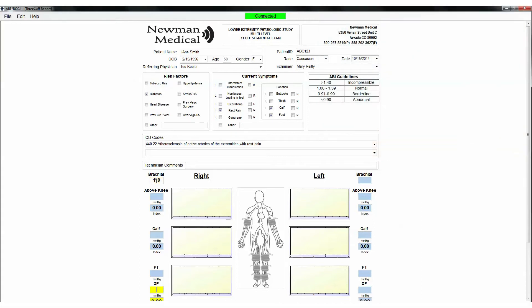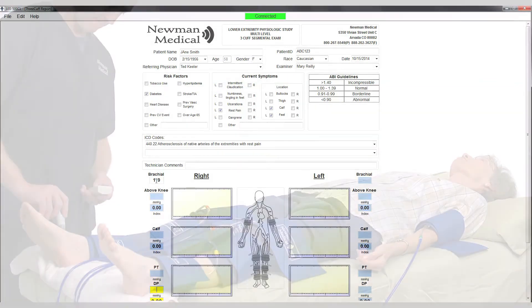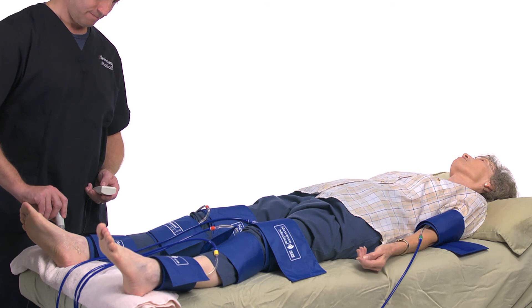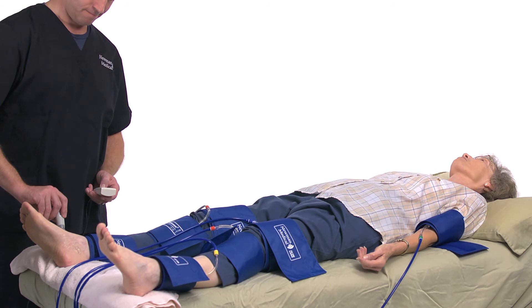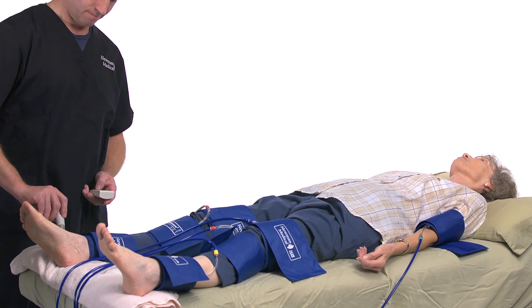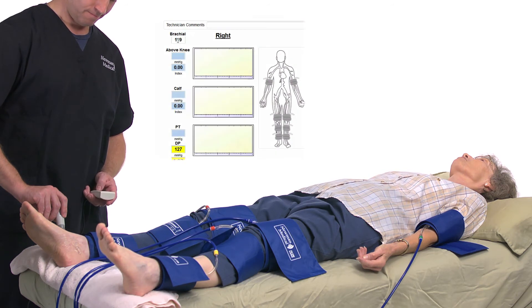When satisfied, press Next on the remote and the system will move to the right DP. Take an ankle pressure using the Doppler probe, this time on the DP on top of the foot. Press and hold Inflate until blood flow is occluded plus 20 mm. Release, and once blood flow is heard, press Pressure to enter the pressure in the DP field.